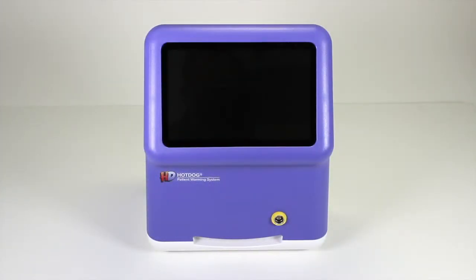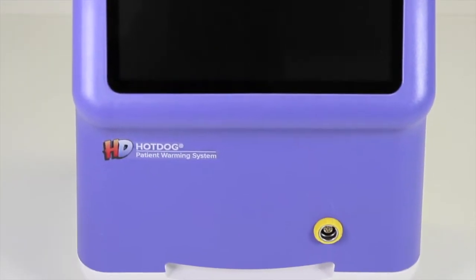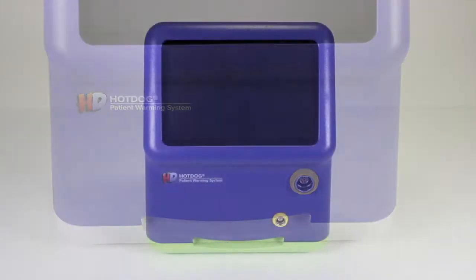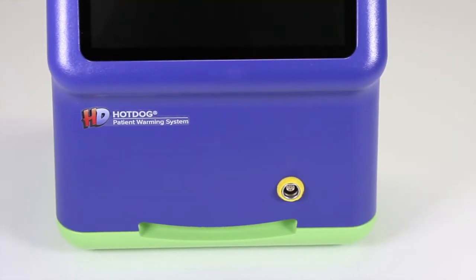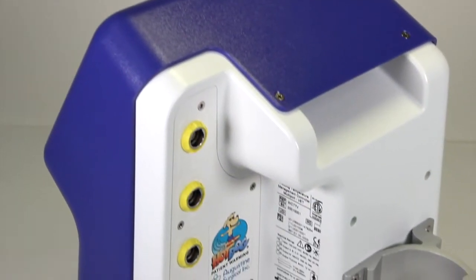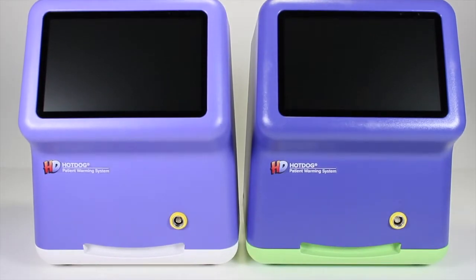The WC7-1 single port controller operates one blanket and is primarily used in the pre-op or post-operative setting. The WC7-7 multi-port controller can power up to four blankets and one mattress. At first glance, they look very similar with one blanket port in the front.